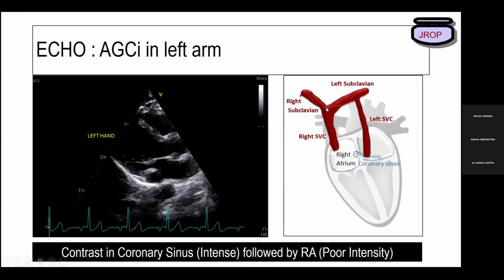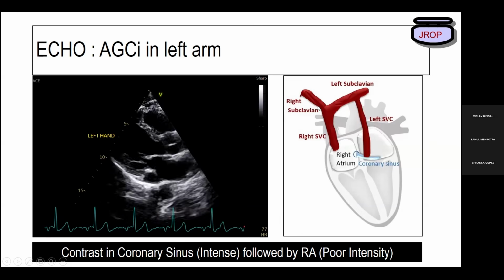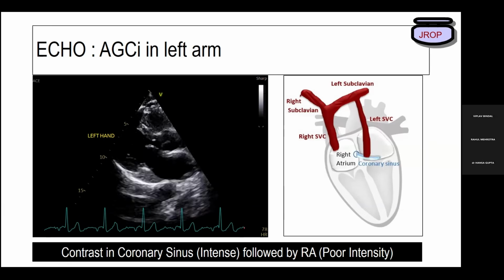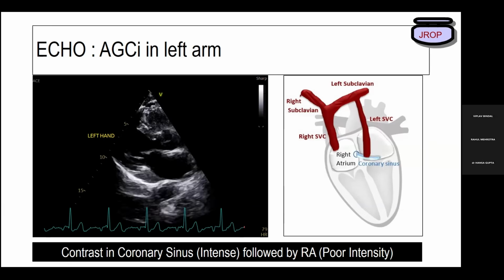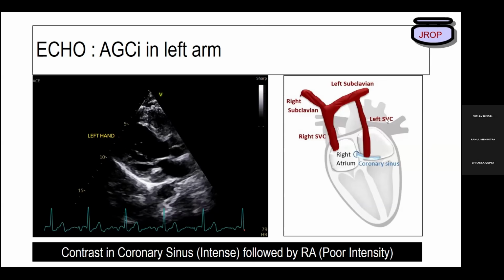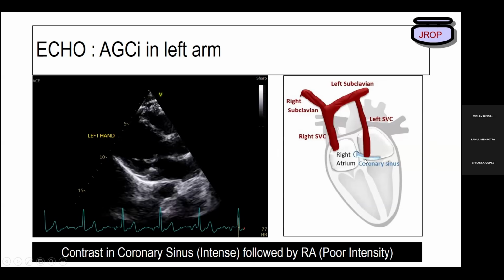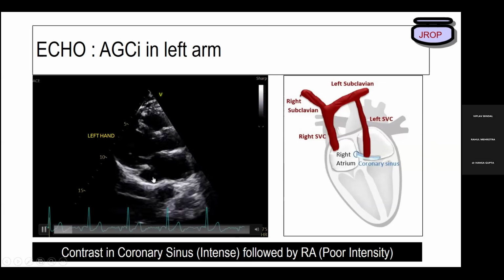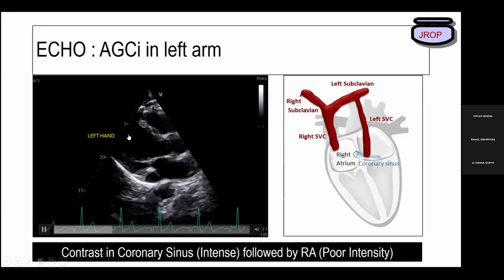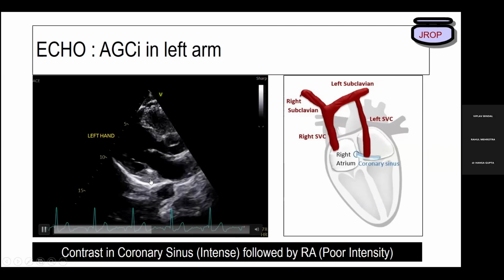It will not go up. It will come from the brachiocephalic vein, come like this and go to the coronary sinus rather than draining into the right superior vena cava. And this classically tells you that we are dealing with a left-sided persistent superior vena cava, left-sided SVC, along with a dilated coronary sinus. And that's the importance of this abnormality. One indication I said was when the RV and RA are dilated. Here my RV and RA are not dilated, but I have a dilated coronary sinus.